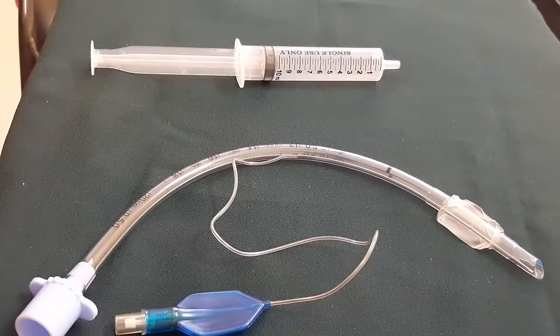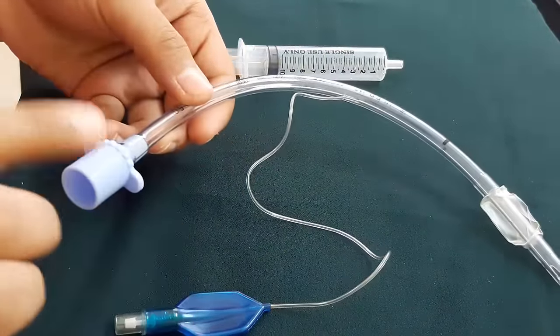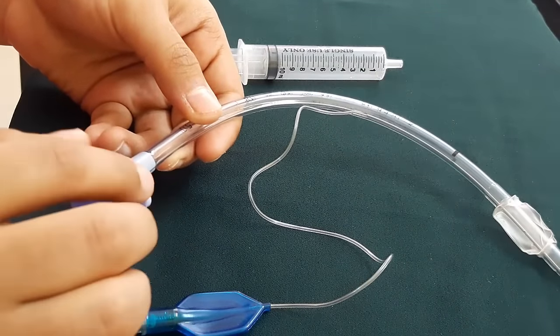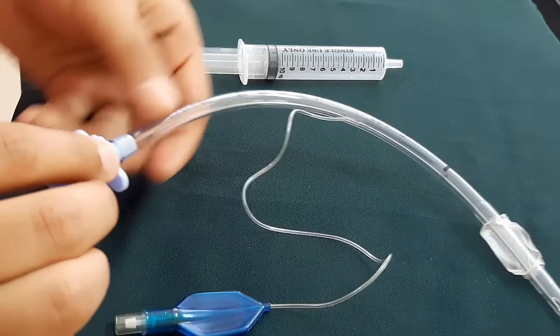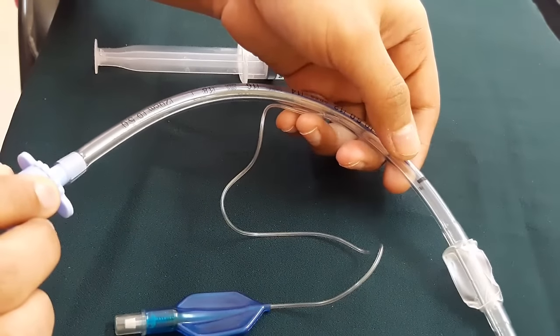Now let us talk about the parts of the ET tube. We start from the proximal end — as you can see, there is a 15 mm adapter or connector which fits to a ventilator or the Ambu bag. Moving on to the central portion of the tube, you can see a vocal cord guide.